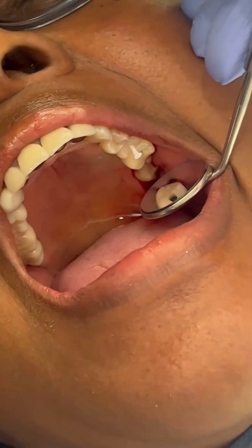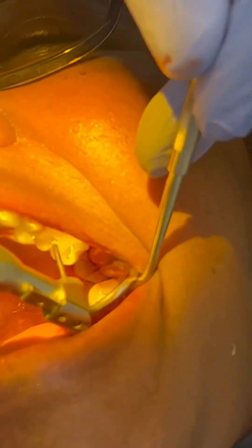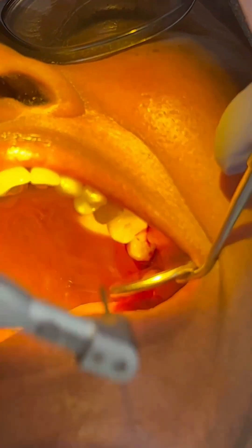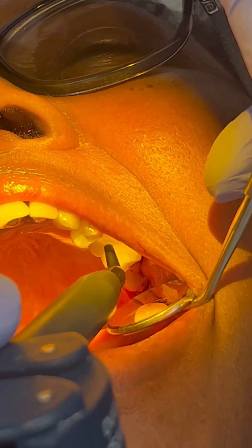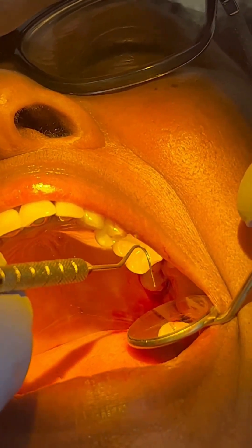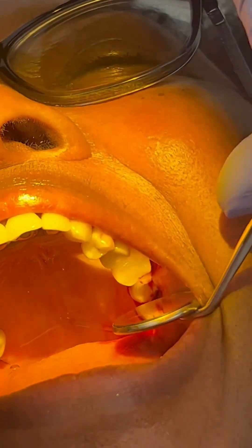There's our Teflon rope. Pusher. Teflon rope. Here's the back end of the Explorer, and then I take a micro brush.